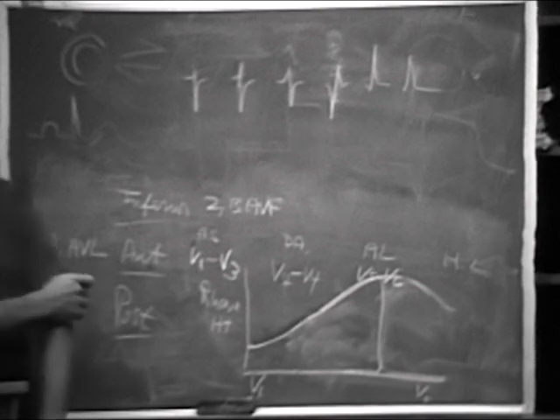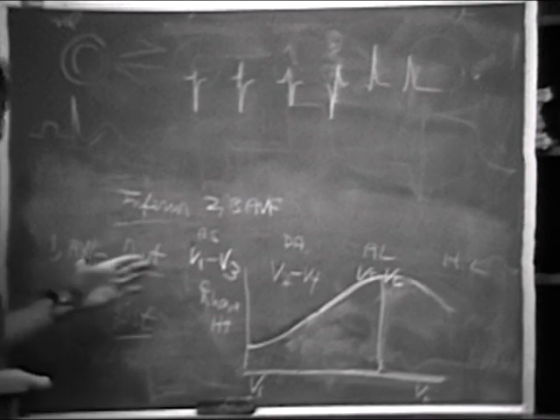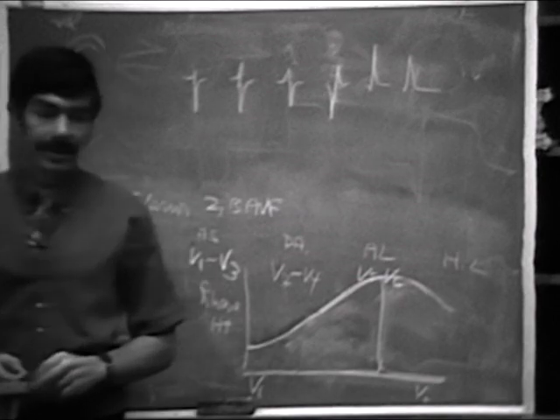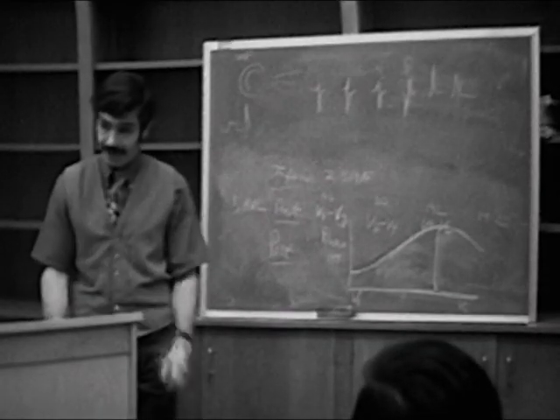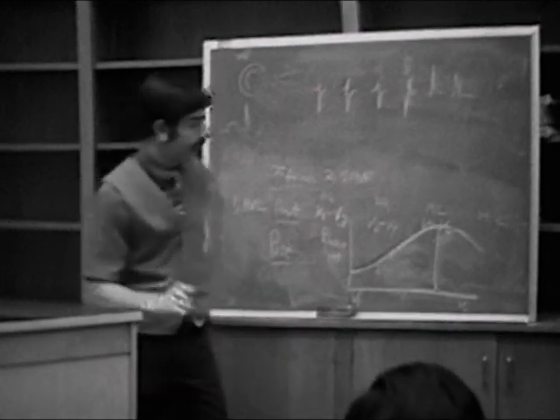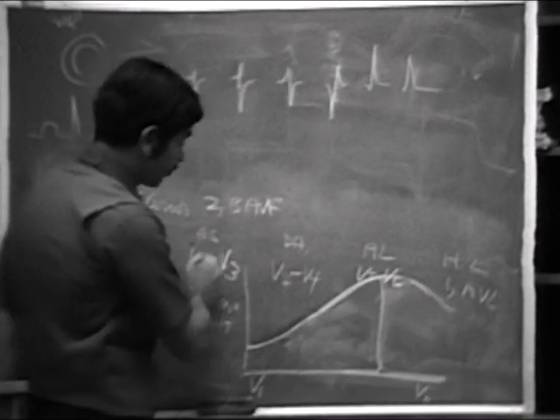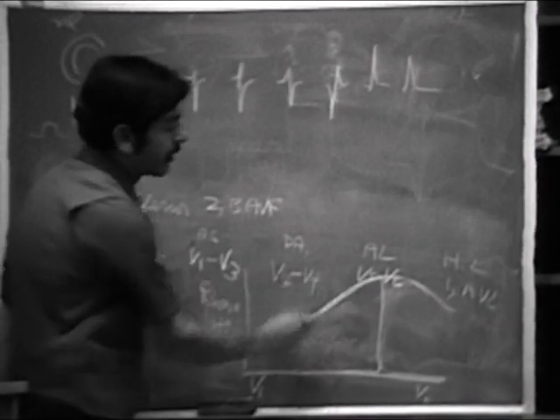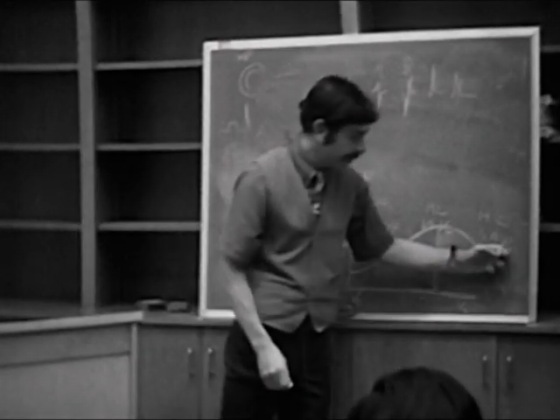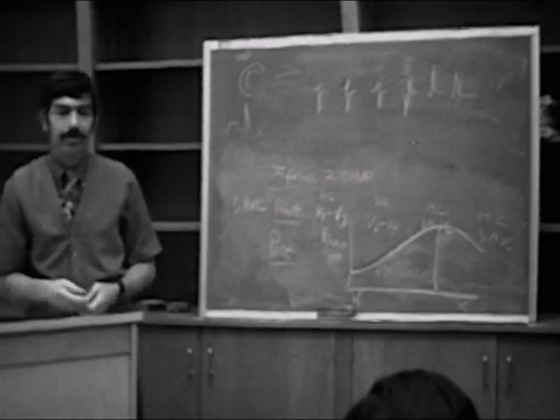There is a certain type of infarct where we just see changes in lead 1 and AVL, and we do not see any changes in the anterior wall at all of the type that we've described. These are called by some people high lateral infarctions. They're way around in the back here, high lateral wall infarctions. So we get our changes maybe just in 1 and AVL. In anteroseptal, direct anterior, and anterolateral infarcts, we very frequently see also changes in 1 and AVL. But if we just see changes in 1 and AVL and not in the precordial leads, we might make a diagnosis of a high lateral wall infarction.